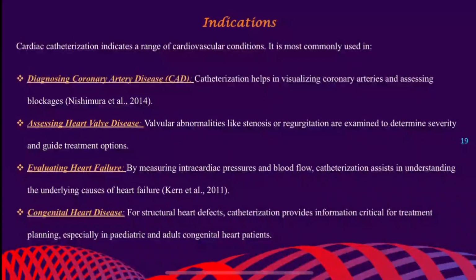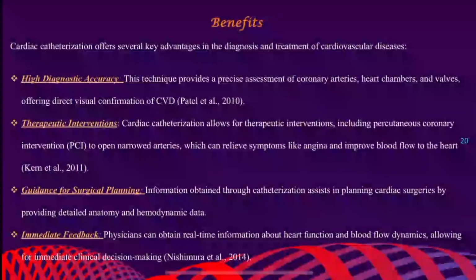Evaluating heart failure. By measuring intracardiac pressures and blood flow, catheterization allows understanding of the underlying causes of heart failure. Congenital heart disease. For structural heart defects, catheterization provides information critical for treatment planning, especially in pediatric and adult congenital heart patients.